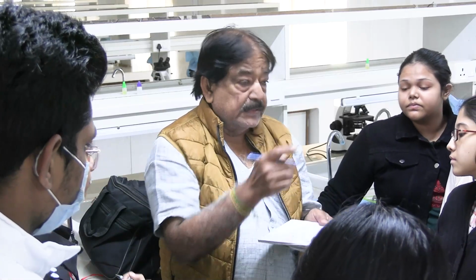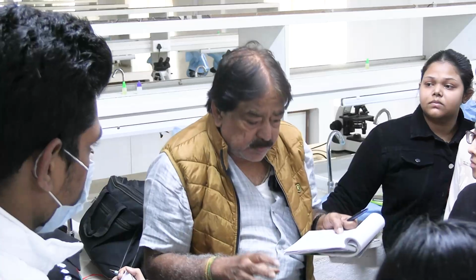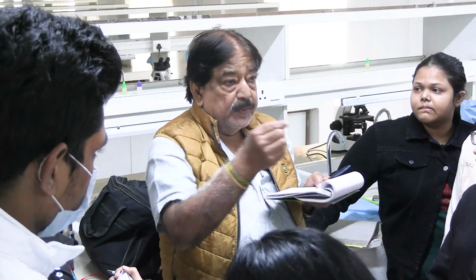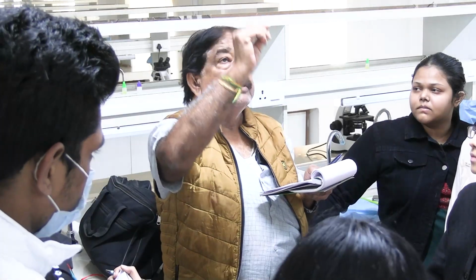Now if this is the thing, when you match it with the book, you may say, sir, this is a bit different. No, it is because of the processing that it is moved a little. Now under the microscope, when you view the slide directly against light, you see a little small circle.